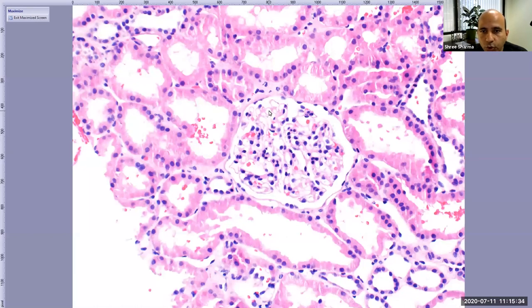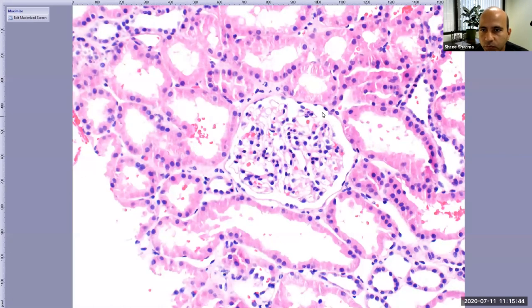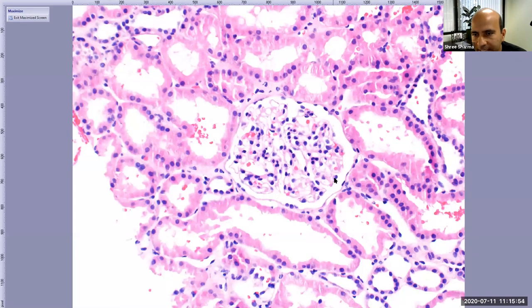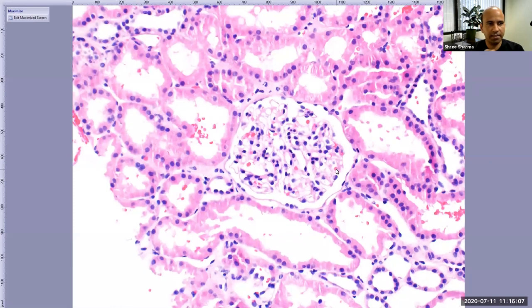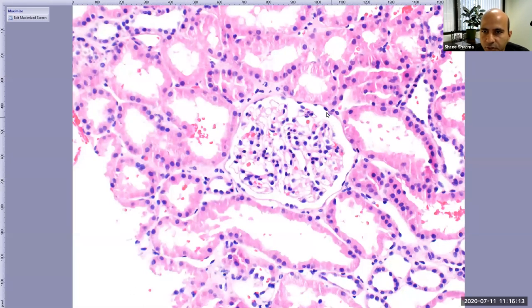I can see the capillary loops are open — I don't see anything within the lumen or outside the loops. This empty space outside the capillary loop is known as Bowman's space. I can see some flat dark blue nuclei just hugging the glomerular tuft from outside — these are podocytes, or visceral epithelial cells. The nuclei lining the other aspect of the Bowman's space are parietal epithelial cells, and this structure is also known as Bowman's capsule.